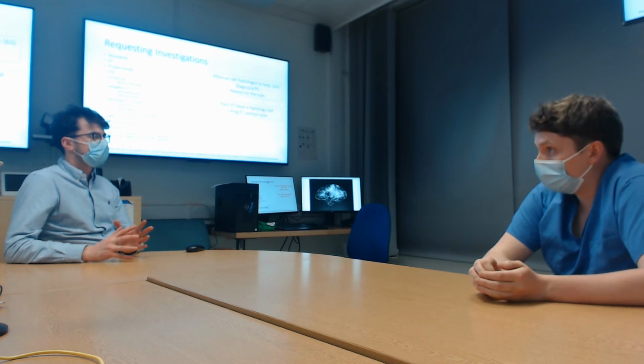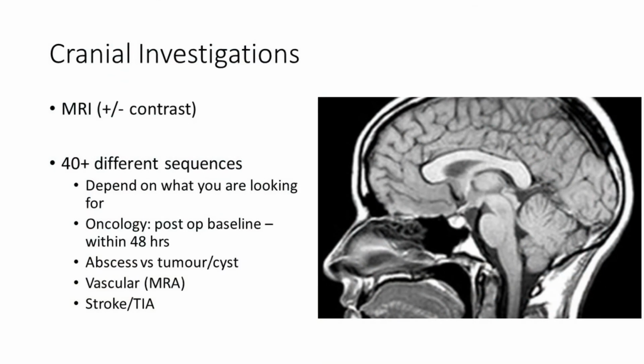You can do, yeah. Depending on what you're looking for. And we do a lot of that here, both cranial and lumbar. And then often if you're trying to do lumbar, and the most common one is for cauda equina, they'll often scan a little bit of the rest of the spine on a standard T2 image just to have a look and make sure there's no compression of the cord anywhere else.